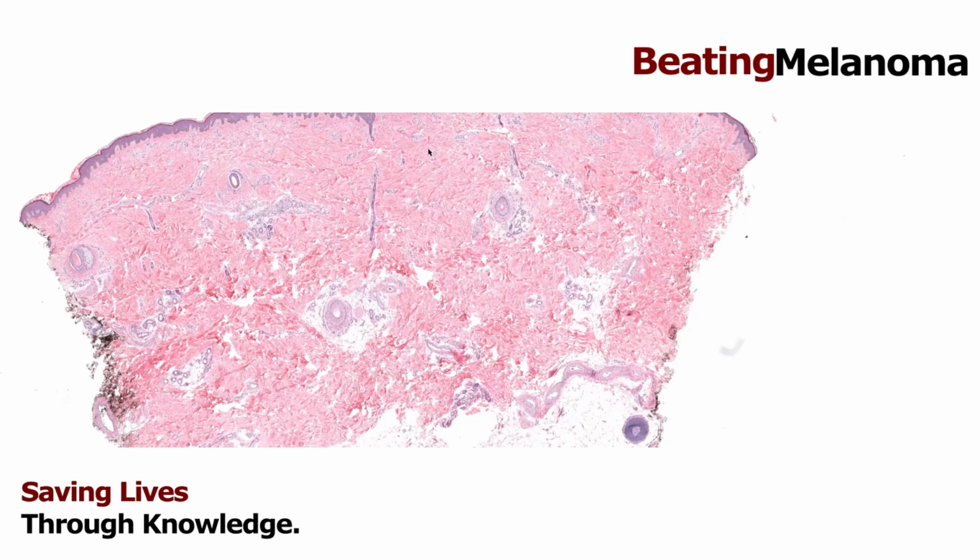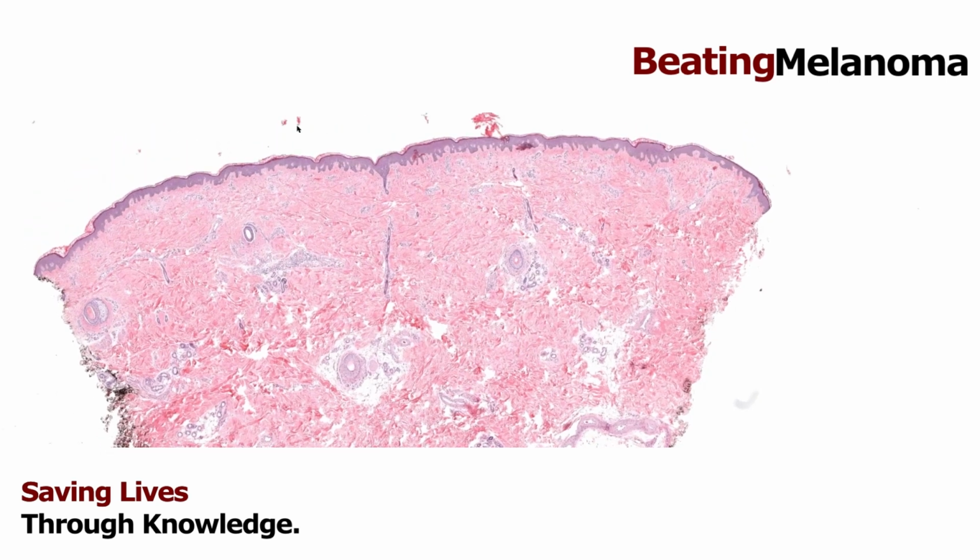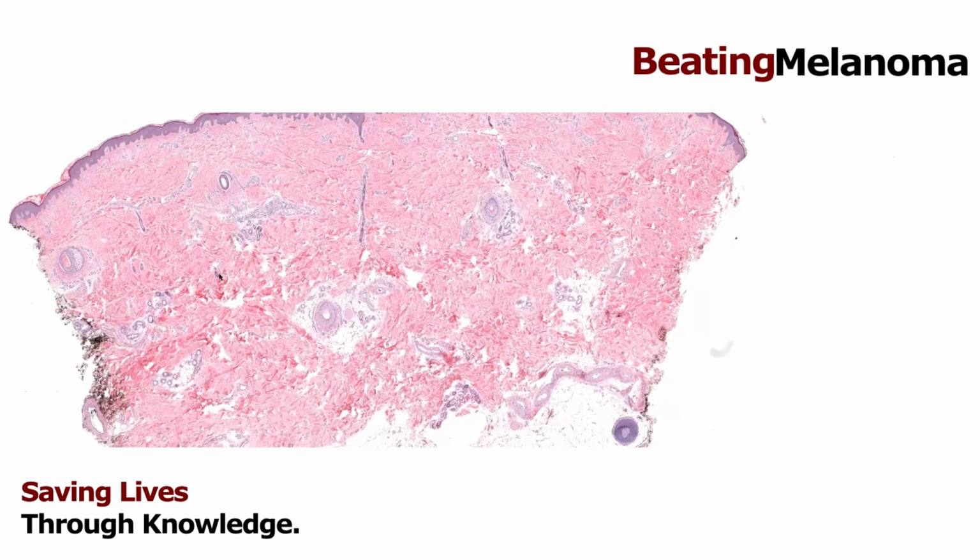So up here is the very top layer, what would be on the surface. When you touch your skin and if you rub your skin, what you're rubbing is this layer right here, okay? That's the very top layer, the epidermis. And then down here underneath it, this pink layer is called the dermis, and it's the layer that kind of supports the epidermis and keeps the epidermis intact. The epidermis's job is to kind of keep everything else out of your body. It's a watertight barrier when it's functioning normally, and it keeps out germs and water and all sorts of chemicals, the elements, everything else around you.